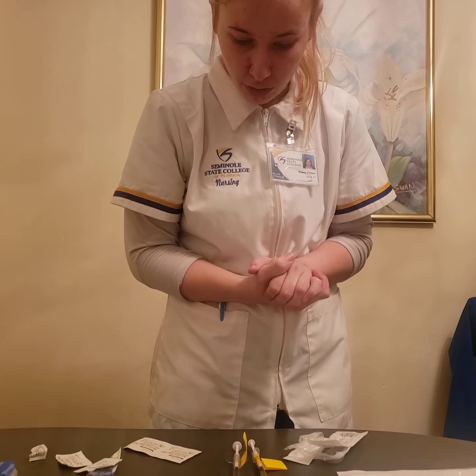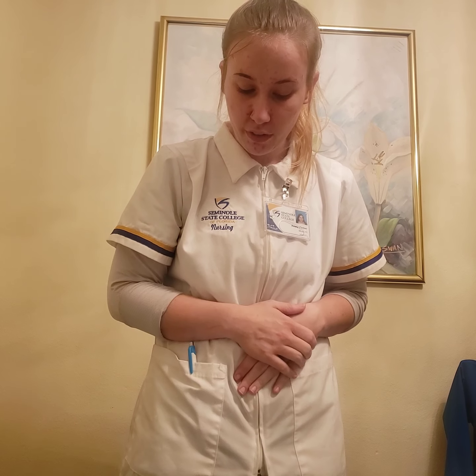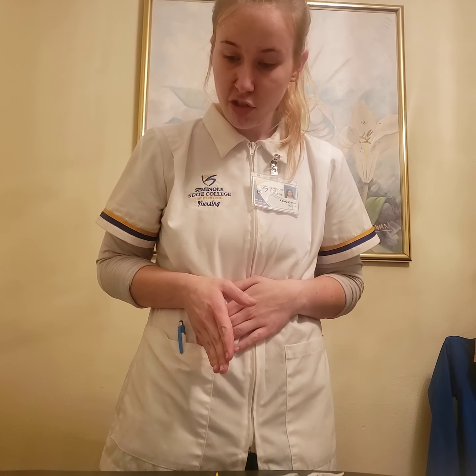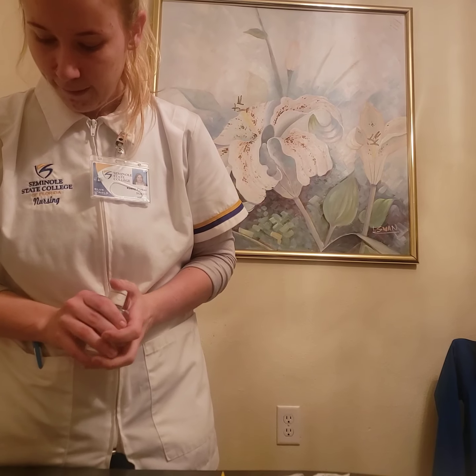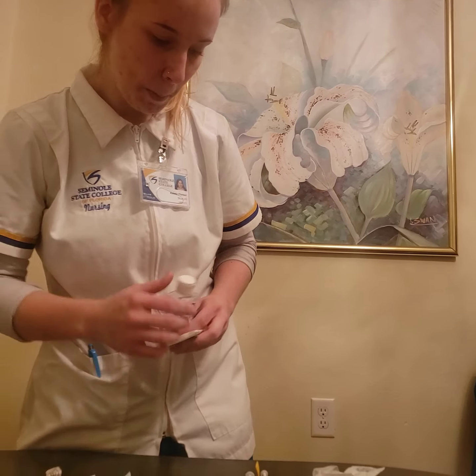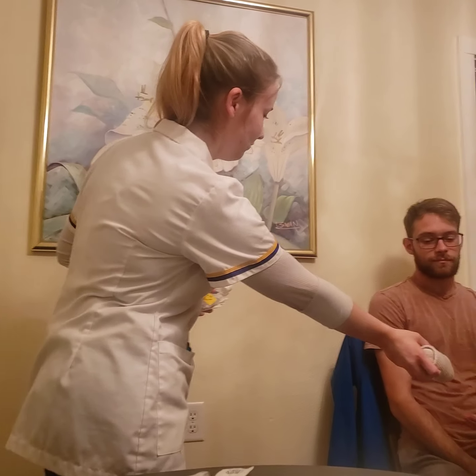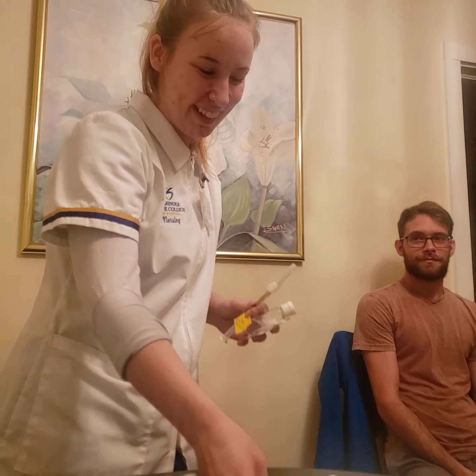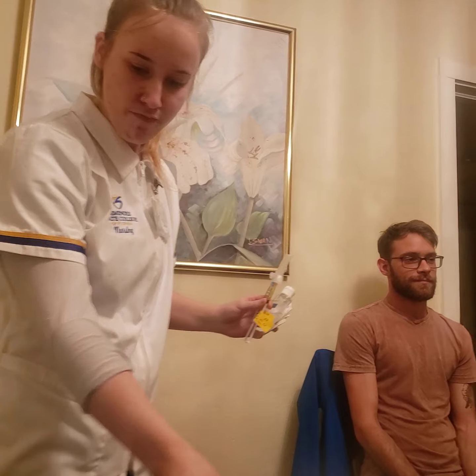Okay, so now I'm going to be doing, okay, I did that check. So that was my second check, as I've done both of those. I did my first check, now I've done my second check. I'm going to go into my patient's room and I'll do my third check. Got all my supplies here. And I do have my medication card because I know I'm going to need to educate Mrs. Pawlowski on her medications today.